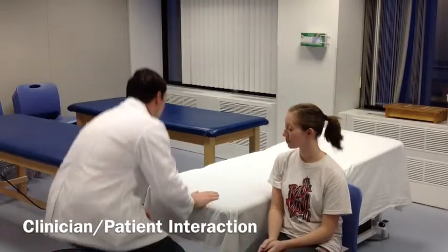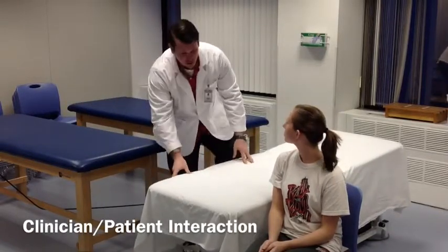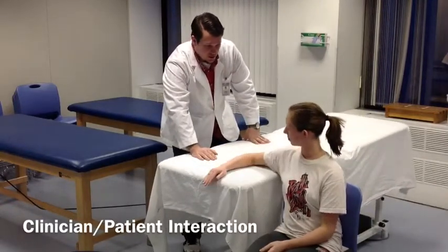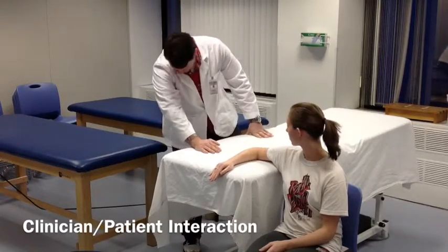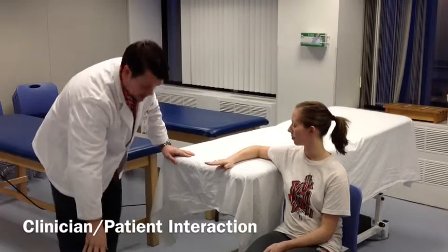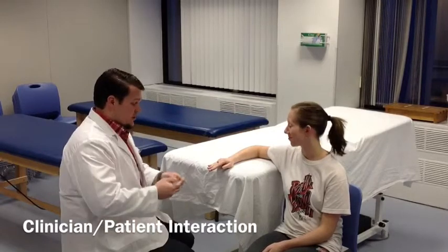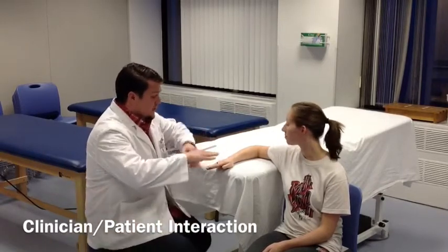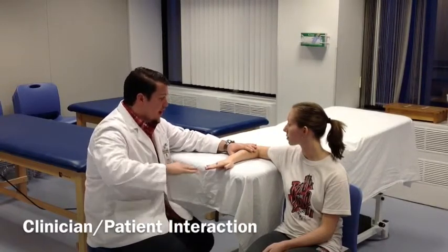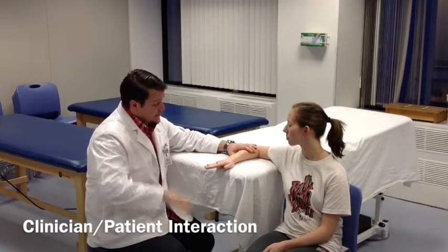That's going to give us some indication of what your range of motion is, what we have to work with, okay? The first thing I need to do is raise this table up so that I can get you in the correct position. If you can just rest your arm up on the table there, we want your shoulder to be at about 90 degrees of abduction. That looks pretty good. And your elbow is going to be at 90 degrees of flexion as well. Now go ahead and go through that movement. I'm just going to stabilize your arm to make sure that you're not compensating with any other movements. Move that wrist out as far as you can.